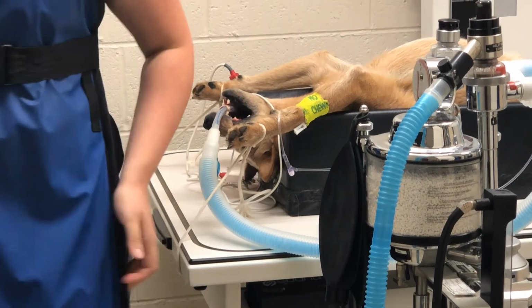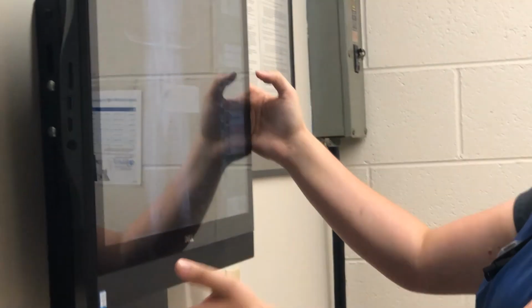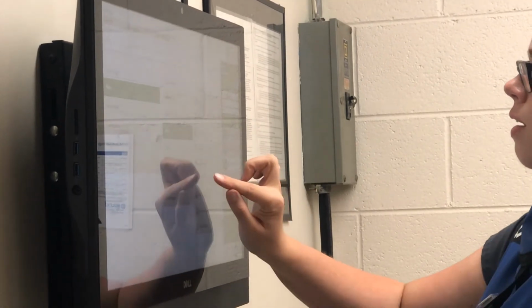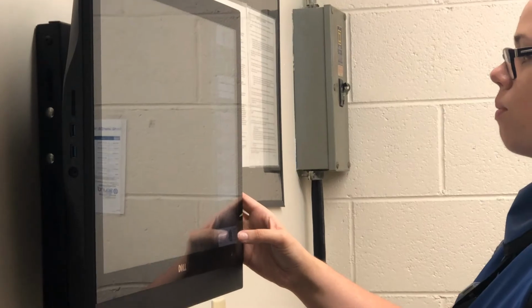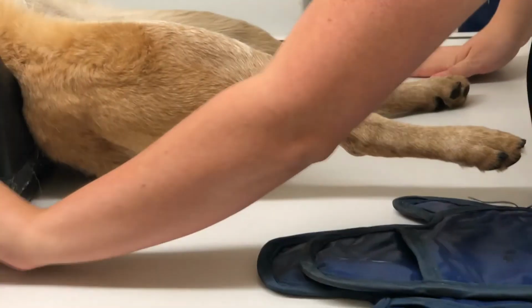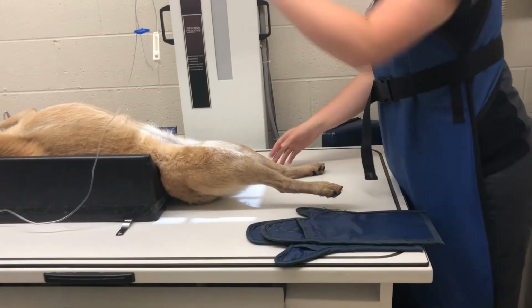And we're going to make sure we add our shot over here also. We're going to do body, pelvis, ventral dorsal. Alright, and we'll come over here. We got our machine on. We have our marker in here to show that that is the right side. We will turn our light on.